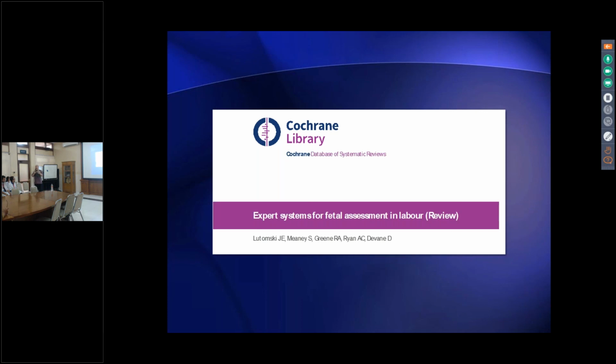to prevent those 2, you have to cast a very wide net and intervene by cesarean section and other means on hundreds of babies. And those interventions aren't without their own consequences of morbidity and indeed mortality. So one way to try and help the situation is, let's take out the human being and let's get the machine to interpret the CTG, because it will do so more standardized, remove the human subjectivity, and let that help. So we've looked at that. What difference does that make?